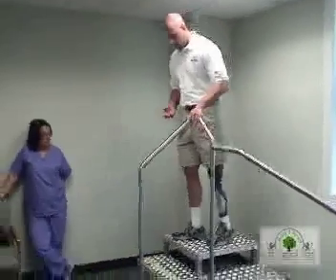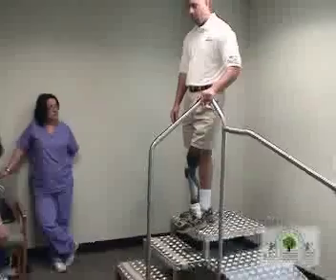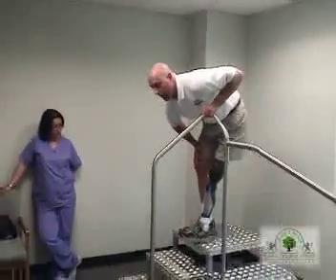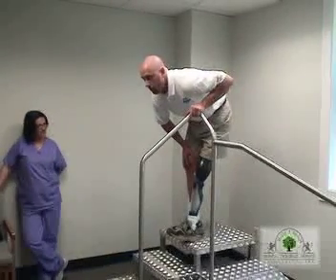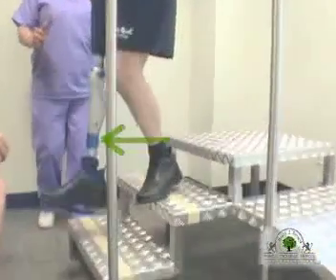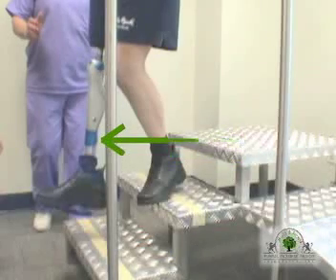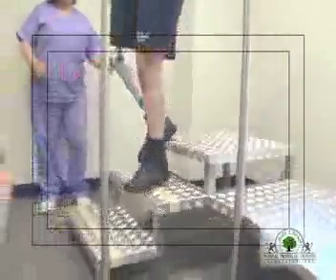So the thing with steps is only putting the back third of the shoe on the step. That way, when the knee is straight, there's no pressure on the toe. And then you just roll it off to the next step, and it stays in the same boat, to give you that resistance to ride it down.